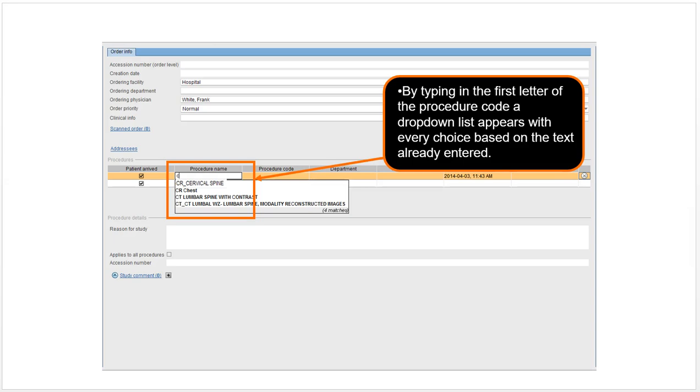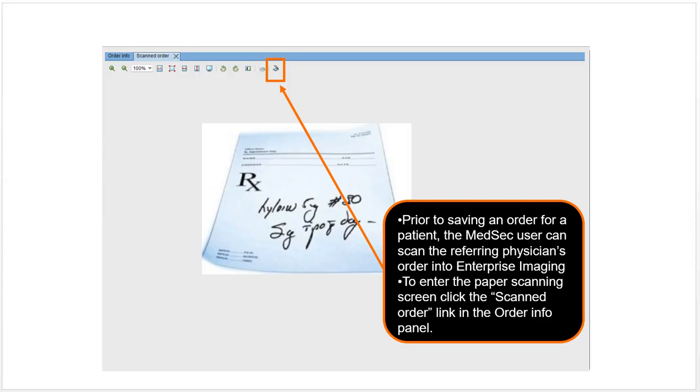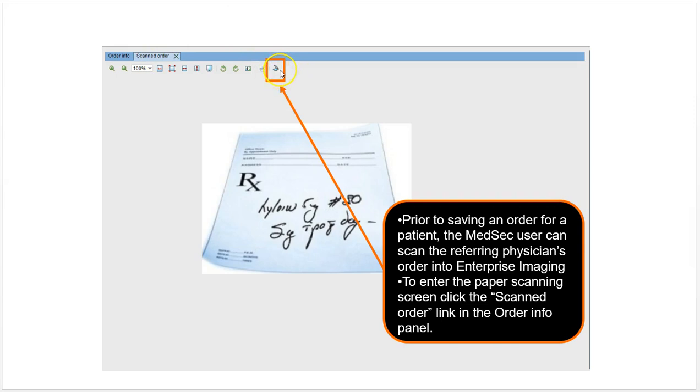When you go to put in orders, you'll have these boxes. You'll want to fill in the procedure name, the procedure code, the department—that's how you choose a procedure. If you need to scan an order in or scan a report in, you switch this tab from the order info to the scanned order portion, and once you have your paper in the scanner, you click that and it will process the paper through the scanner.